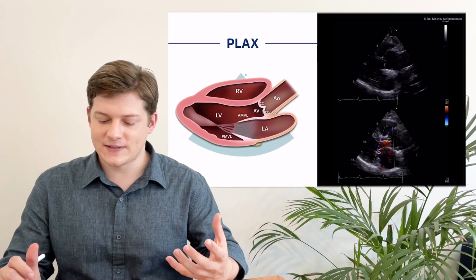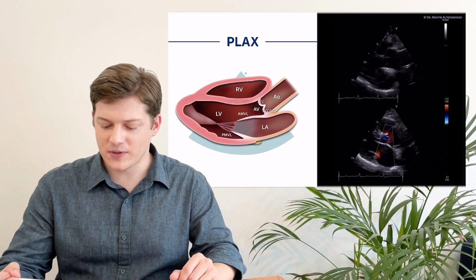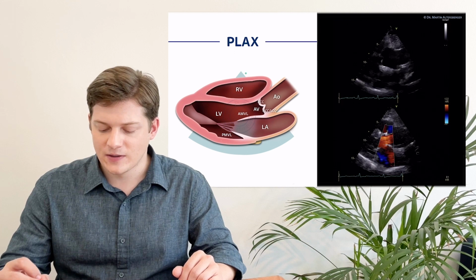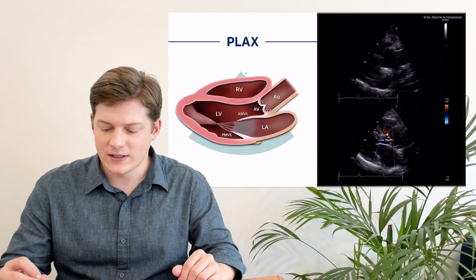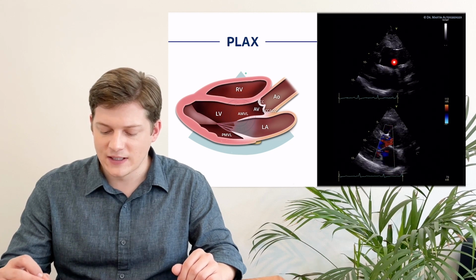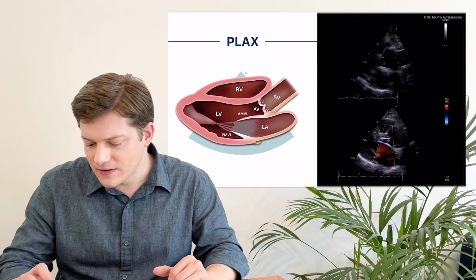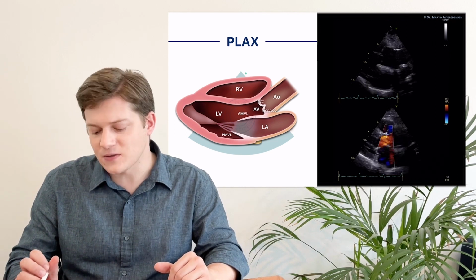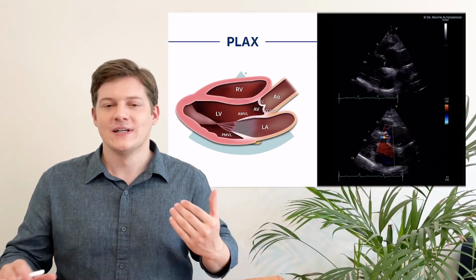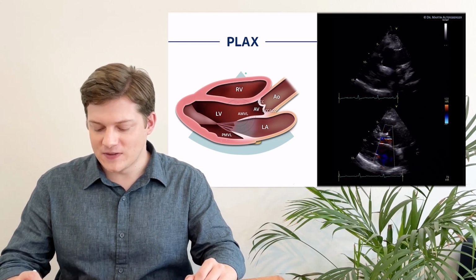If we move on to the next patient, we will again see a case of aortic regurgitation, but I want to focus your attention on this structure here. That's the bulbous of the aorta. So this is the aortic valve, this is the ascending aorta, and this structure over here is definitely enlarged. There's another structure we can see over here. It seems echogenic. It's also visualized over here. This is a patient who had a rupture of the aorta, and this is a prosthesis of the ascending aorta. So also keep that in mind if you see that.